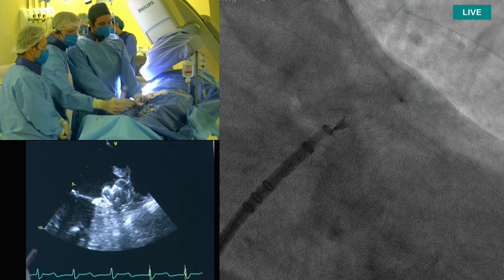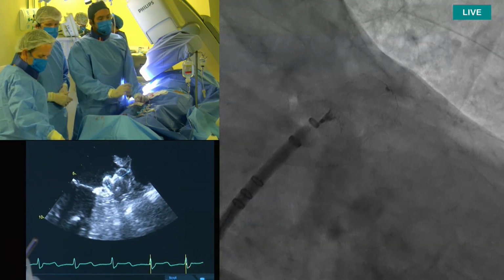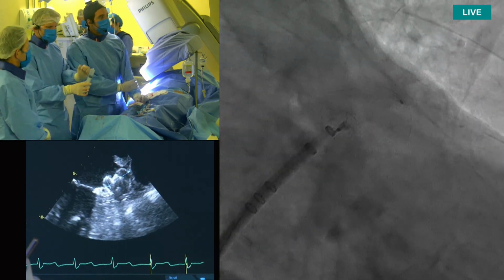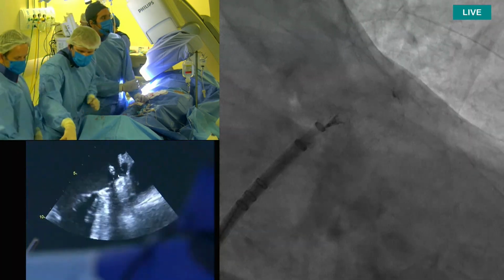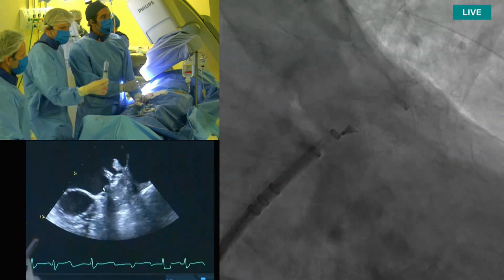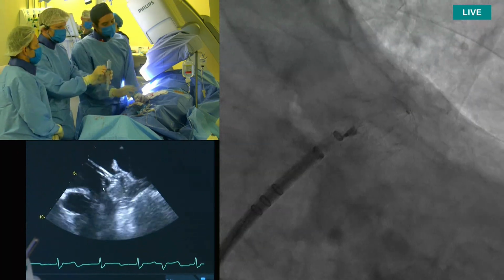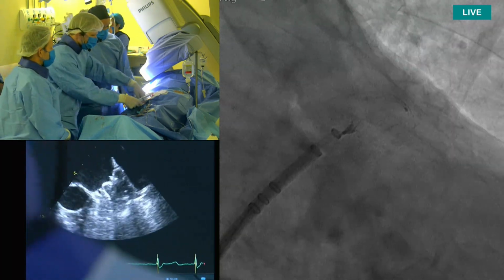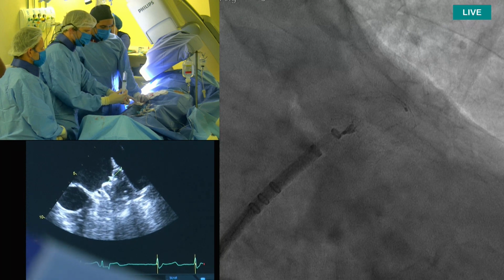Okay, so let's maybe, we can also make a small injection. One of the important things to consider just right after we were releasing the device is that different from the first generation, the way we deliver this new device, the Flex device, is way softer, it's way more controlled. And after we have it all fully open, I would say, we keep a tiny little bit of pressure for 10 seconds, just to be sure that the anchors are gonna do what they have to. Yeah, and we have to do a tug too, yes? Yes, we're gonna get there.